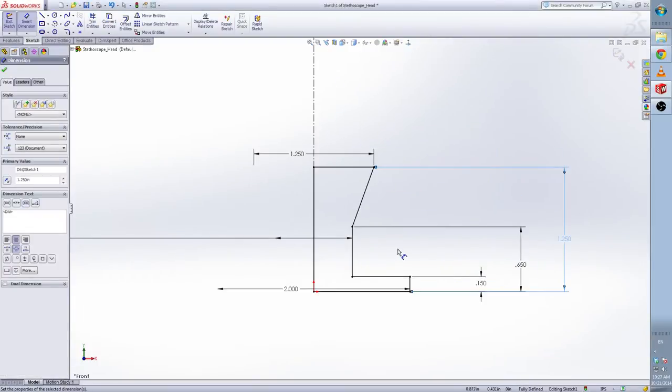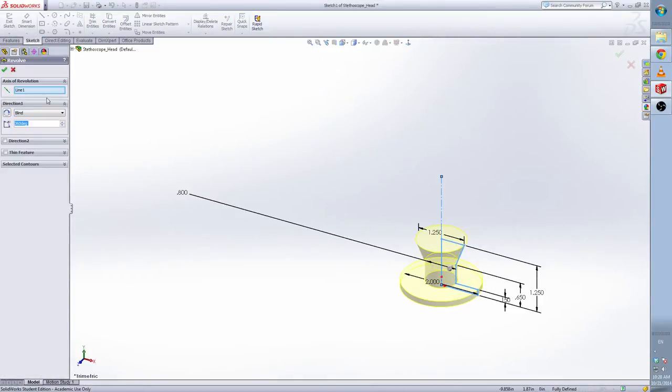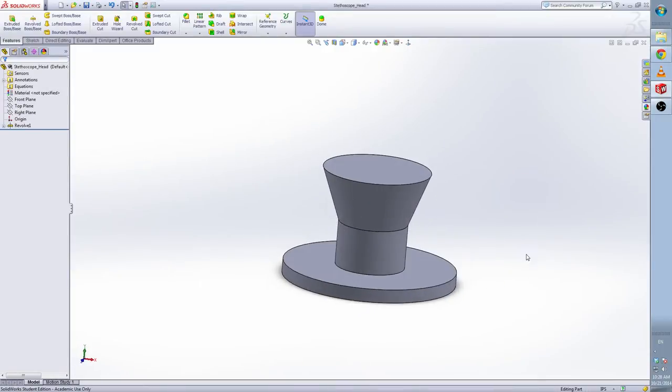Now we fully define this sketch. Just escape the sketch and do the revolve. Now you can see basically what the head part looks like.